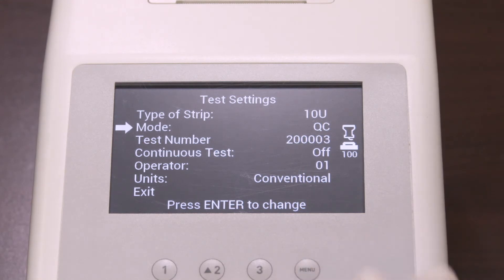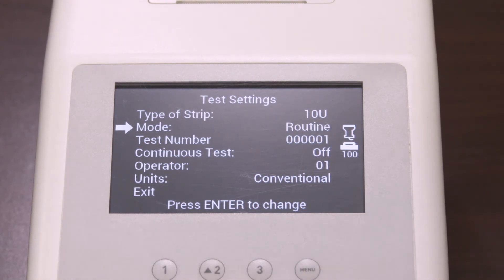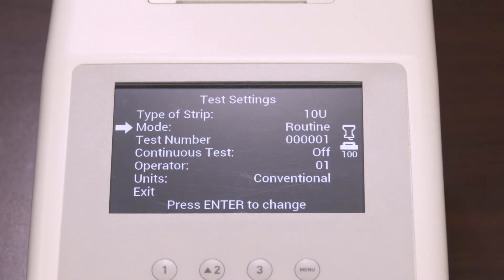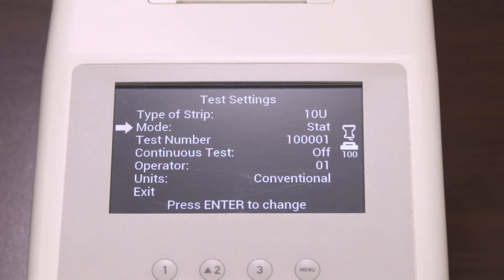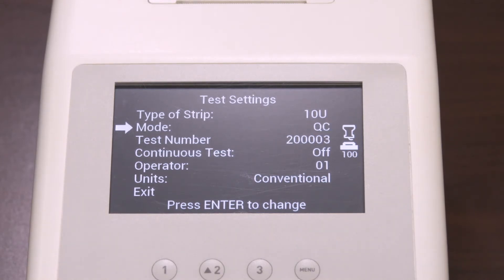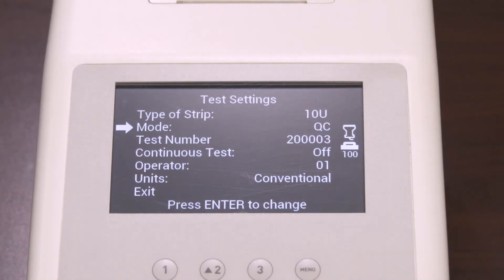There are three test mode options. Routine test is used for normal urine testing. Stat test is used for emergency urine testing. Lastly, QC test is used for testing positive or negative controls.